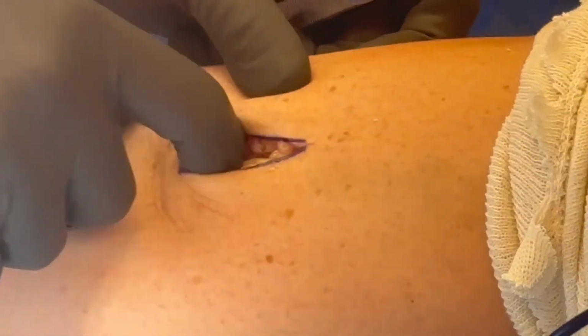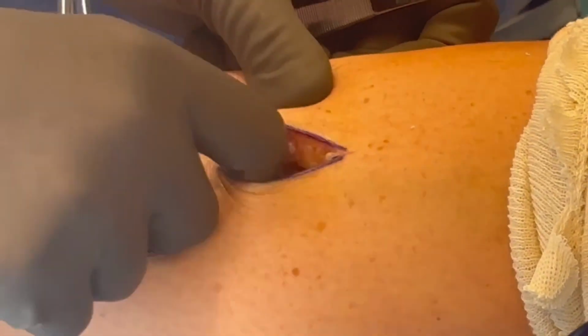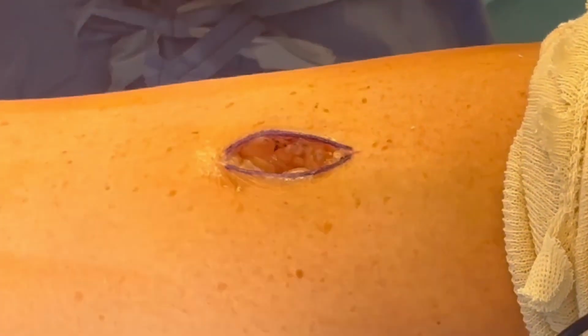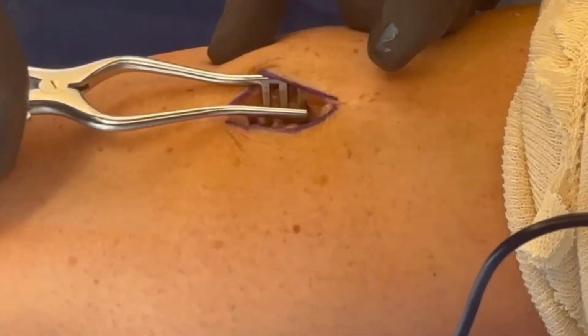It's really important to try to limit the horizontal undermining of the skin edges, which damages the perforators to the skin and can lead to wound dehiscence. Trying to keep your undermining more vertically oriented will help reduce the injury to those perforators to the skin.